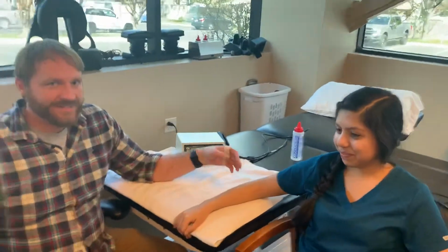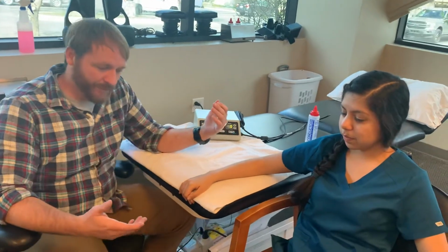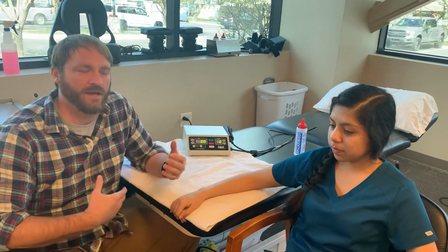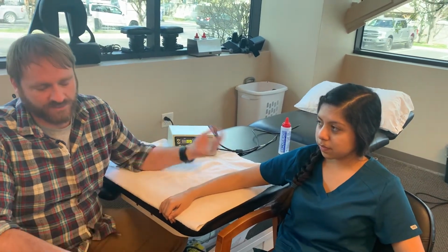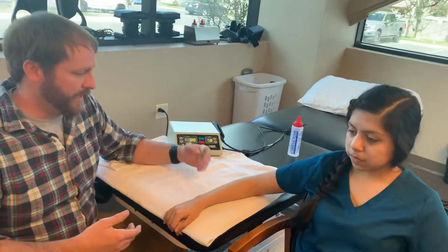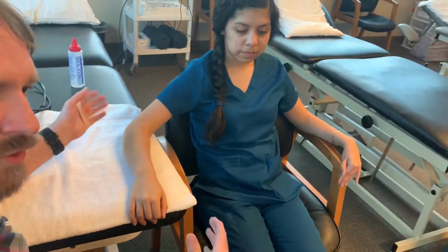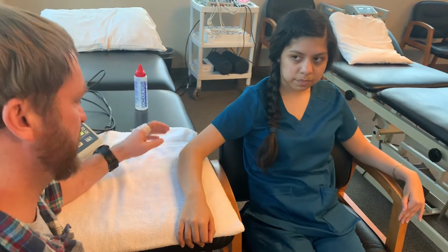So today we're going to be talking about ultrasound application. It's actually relatively simple. There are a few things that you want to consider when you are choosing an ultrasound treatment for a patient, or when the physical therapist is prescribing that for a certain patient. So the first thing we're going to look at is the body area. So we're going to start out with a smaller body part and go through the parameters that we would use for a smaller body part.